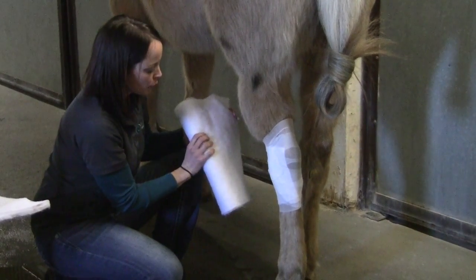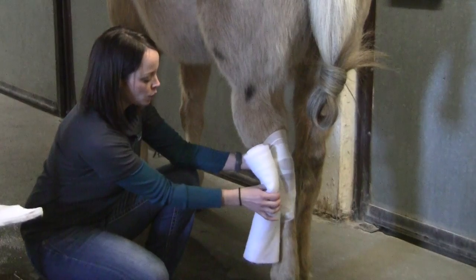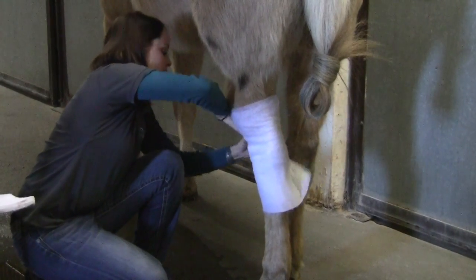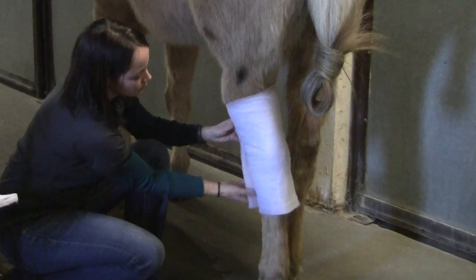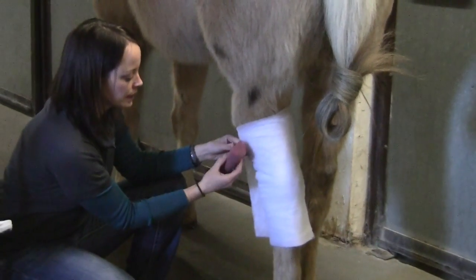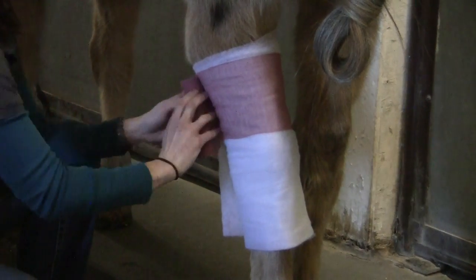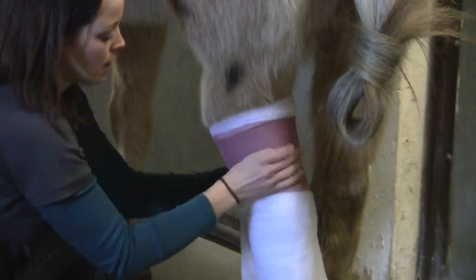When you put your cotton on, make sure you put it on high enough above the hock — your sheet cotton layer is your absorbency. If you start too low it's really common that the bandage is going to slip down. You want to give it nice even width on either side of the hock joint, top and bottom, and then just lay that around the leg taking care not to get any big kinks or bends in it. Then we go to our brown gauze or cling gauze — this is the layer I like to put the most pressure on. I really like this cling because you can't get it too tight but it allows you to put a nice even pressure from top to bottom.